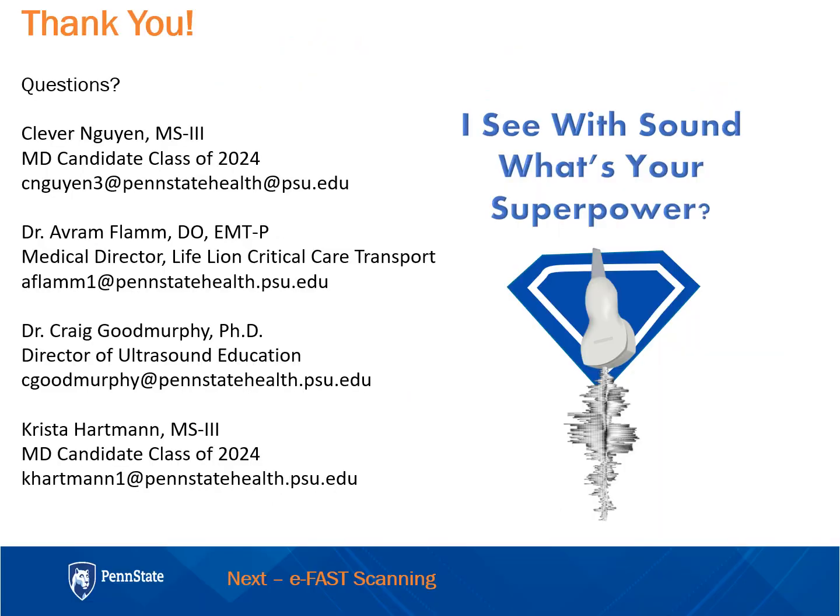Well, that's all for part 2. Hopefully you'll enjoy the ultrasound scanning sessions as you learn the eFAST to help you make determinations of where fluid is, or where air is, and where it should or shouldn't be.